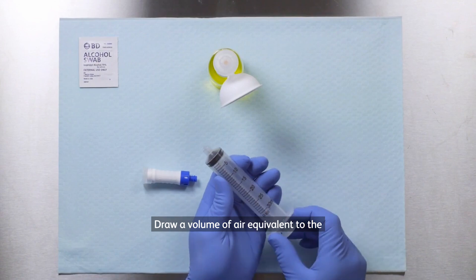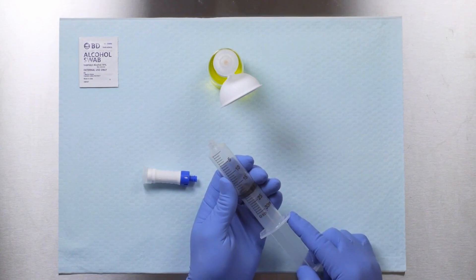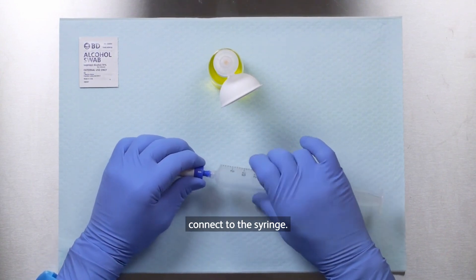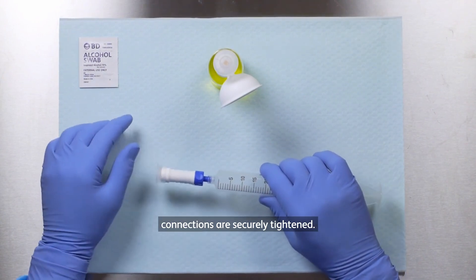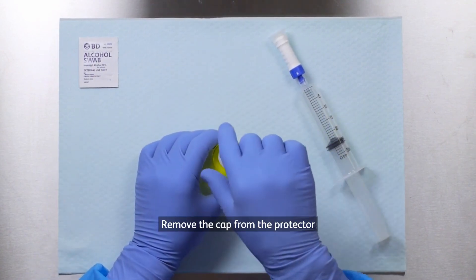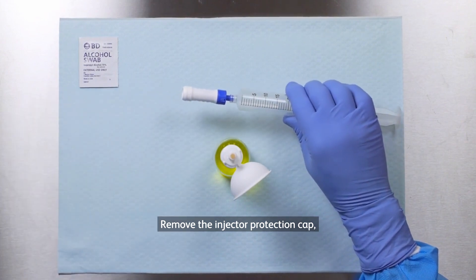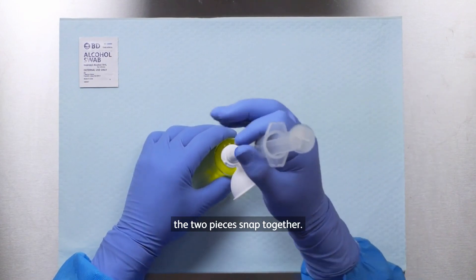Draw a volume of air equivalent to the dose into the syringe. Hold the blue hub on the injector and connect to the syringe. Ensure all luer lock connections are securely tightened. Remove the cap from the protector connection interface. Remove the injector protection cap, and slide the injector straight onto the connection interface until the two pieces snap together.